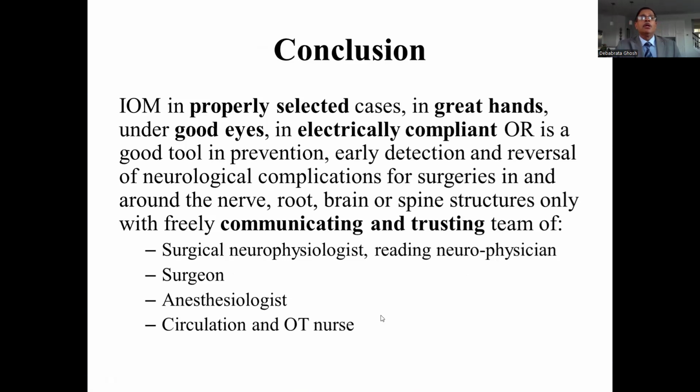Finally, to conclude, intraoperative monitoring in properly selected cases, in great hands, under good eyes, in an electrically compliant OR, is a great tool in prevention, early detection, and reversal of neurological complications. And also very important to have a freely communicating and trusting team of surgical neurophysiologists, reading neurophysician, surgeon, anesthesiologist, and circulating OT nurse. Thank you very much.